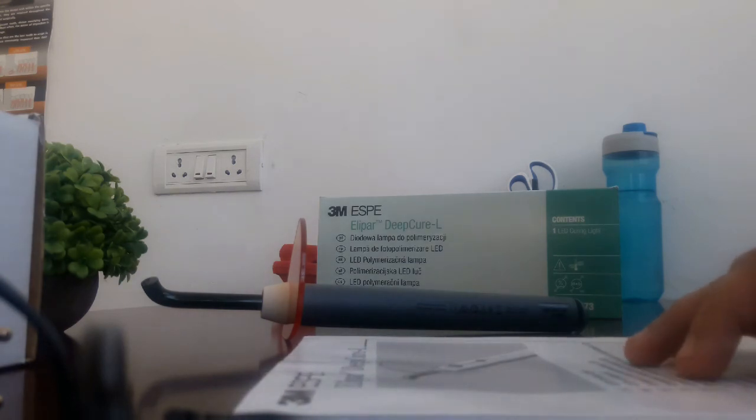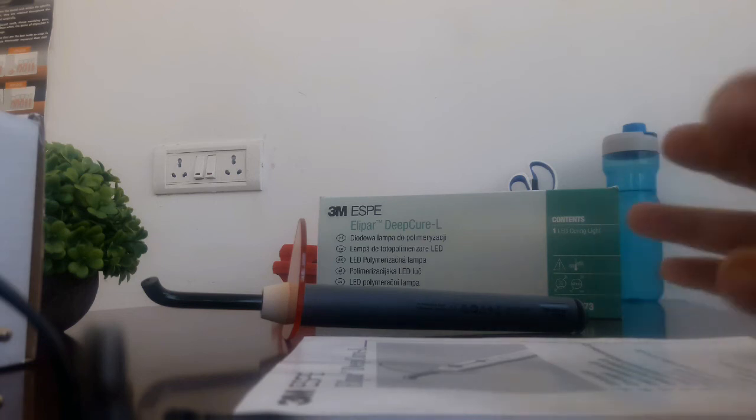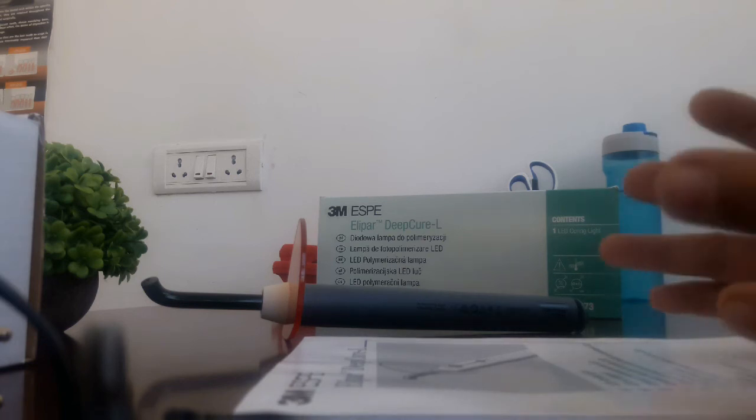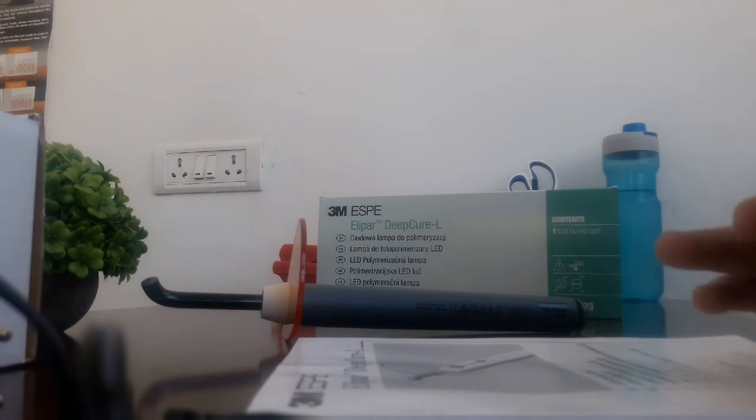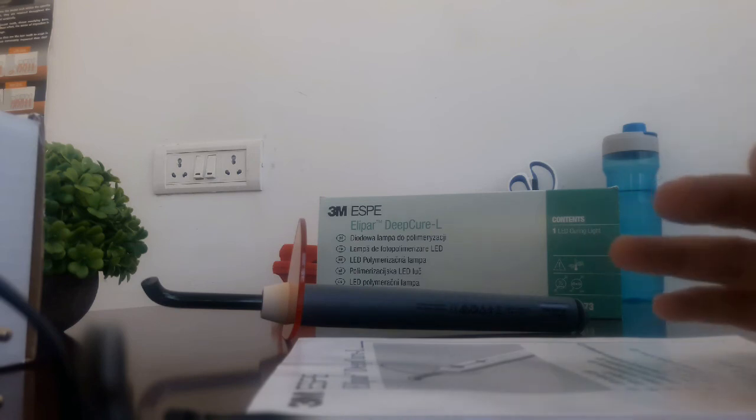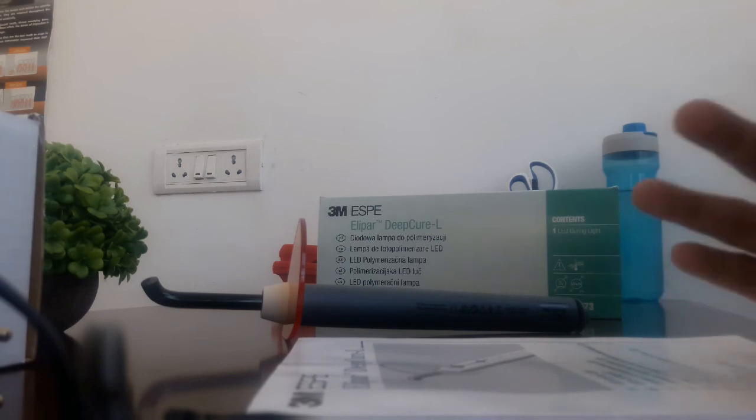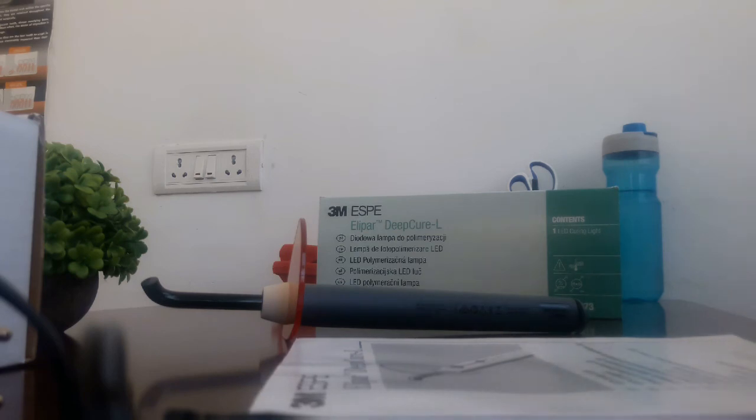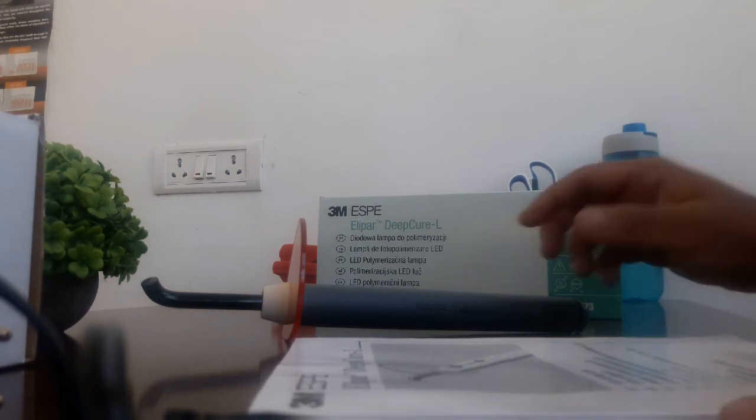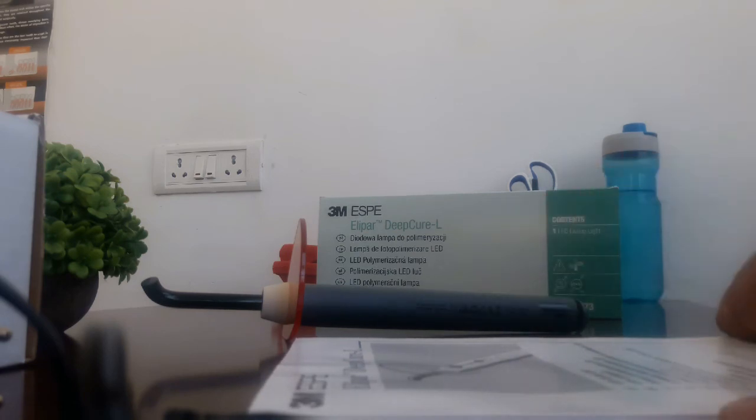It's a great product and I've been using it for two months. I just thought of unboxing it and showing how it works. Whoever wants to get a new LED curing light can go to the link and order this on Dental Cart.